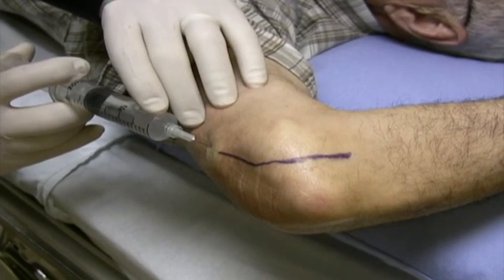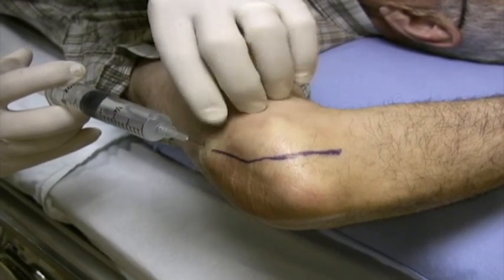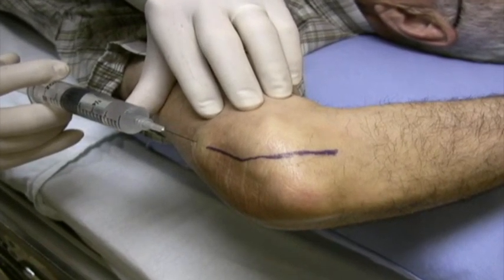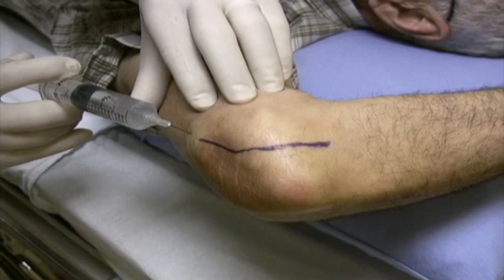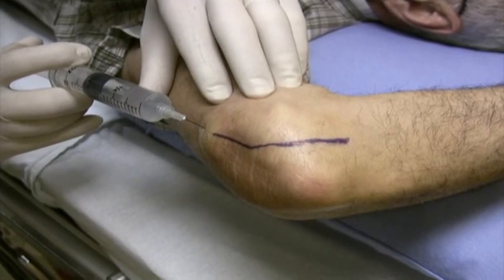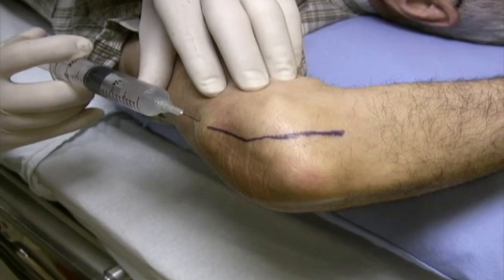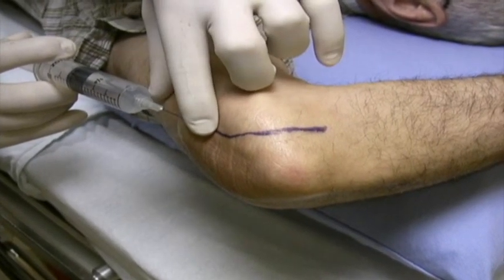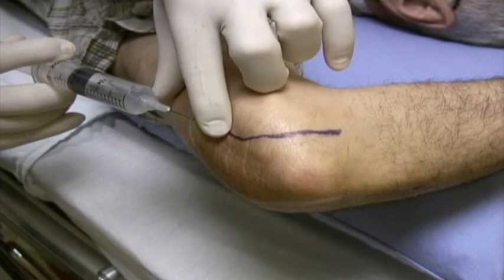And we're continuing to use 0.5% with 1 in 200,000 lidocaine with epinephrine because we're doing both the elbow and the carpal tunnel. In this, it's worth pointing out again about the pH. The normal pH of lidocaine with epinephrine is 3.3 to 5.5. That's a range if you actually read the label on the bottle.